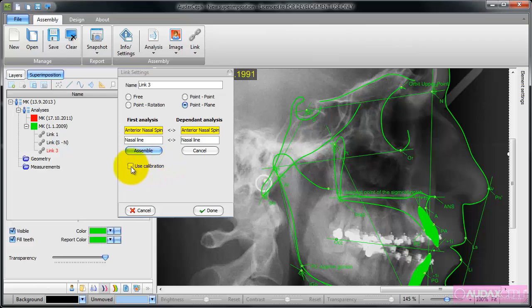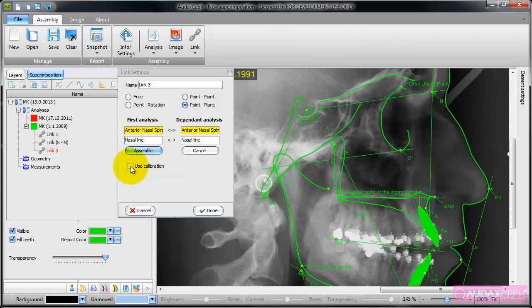I'm going to use calibration in order to position one on top of the other in the right size.